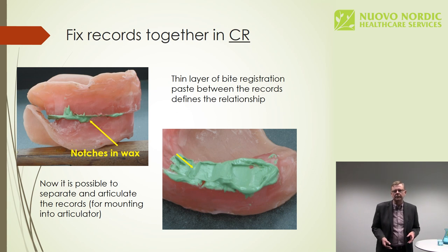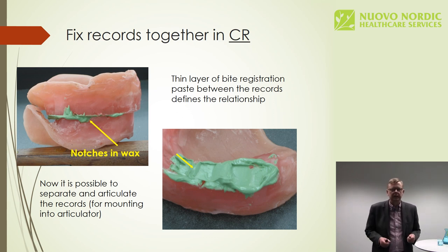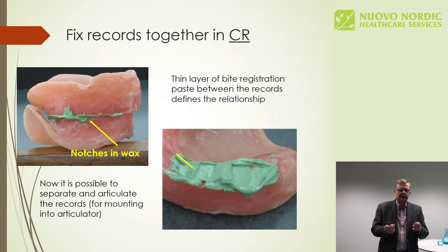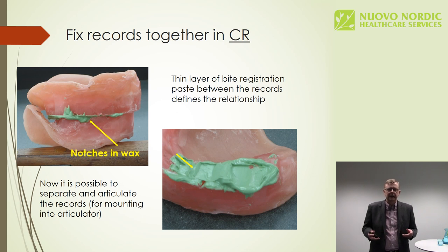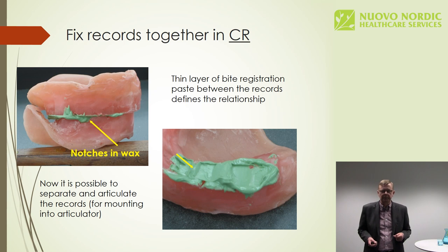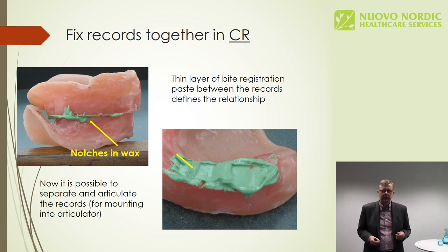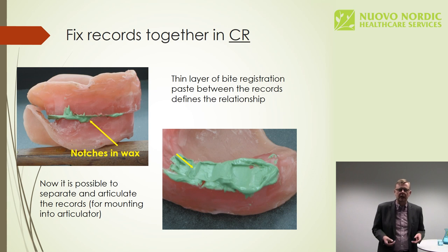Anyway, once you're done with the freeway space and the vertical dimension of occlusion, you will define the working position of the occlusion by gently guiding the lower jaw into CR, which means that the condyles are in the uppermost position, and then the patient will bite down. That's the position where we will build up the occlusion. I'm not going to talk about the different reference positions of the jaws in this presentation.